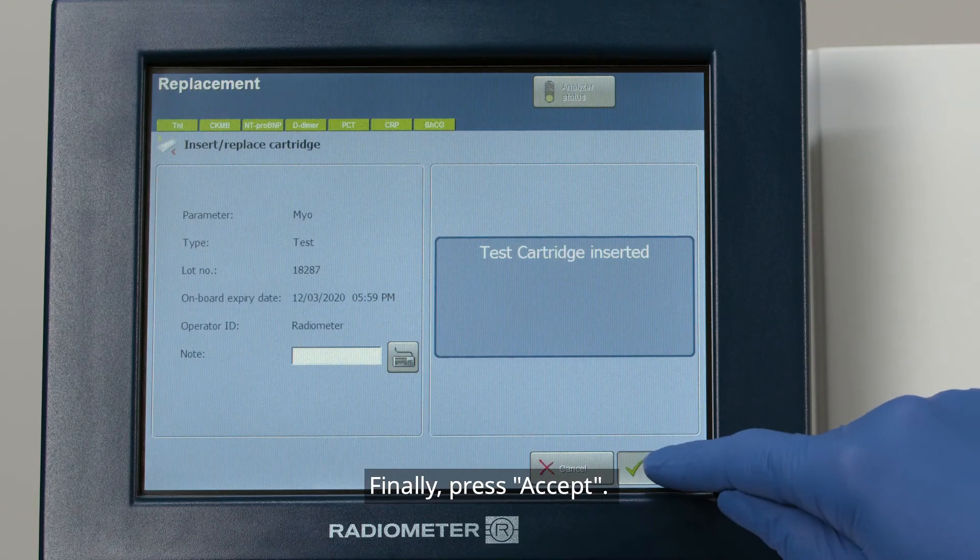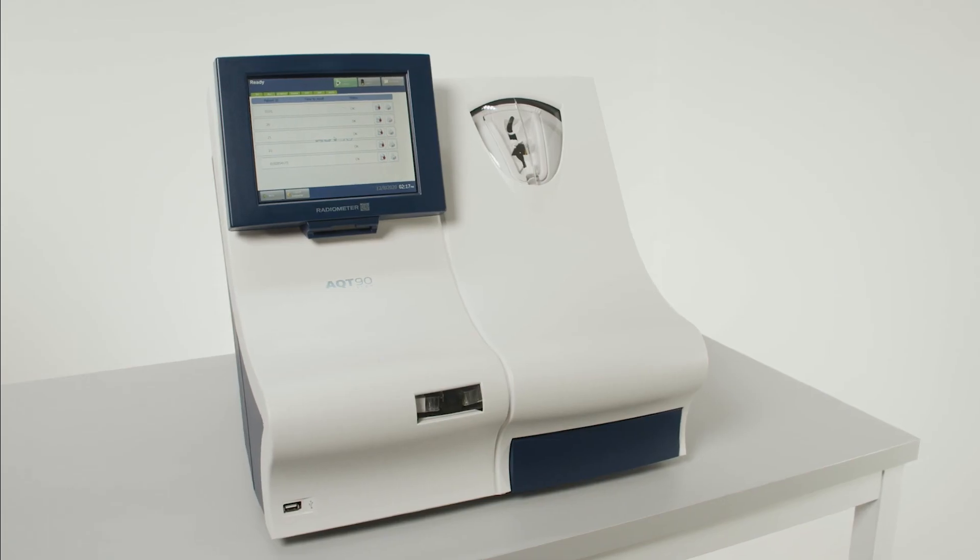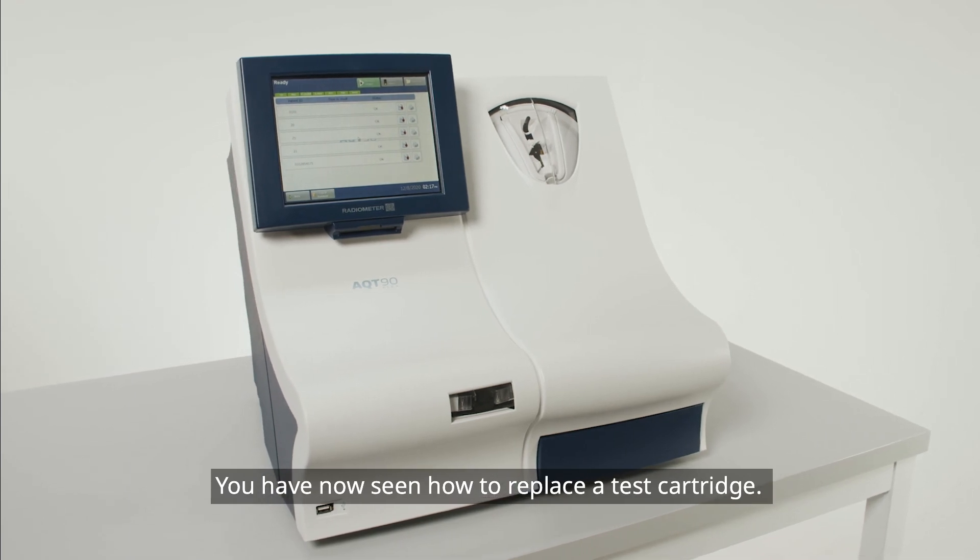Finally, press Accept. This will take you back to the consumable screen. You have now seen how to replace a test cartridge.